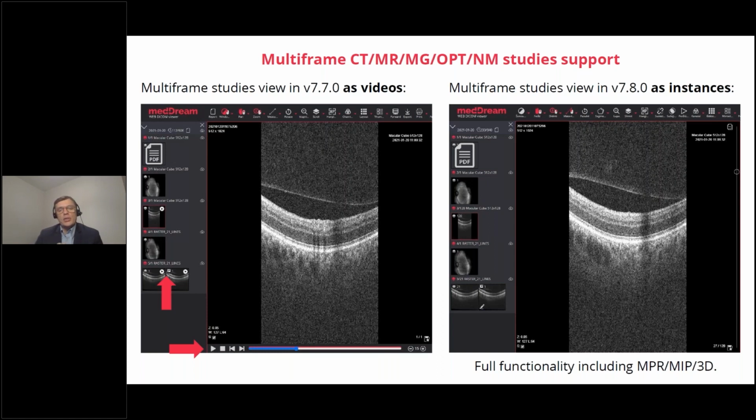With these changes and with personalized hanging protocols, our partners can now really replace the eFilm systems in hospitals, which were very popular for ophthalmology because only a few viewers were able to support OPT, OCT. And as you know, the eFilm system is already discontinued. So it's a big opportunity for our partners to step into this market and give a new quality to hospitals in ophthalmology.